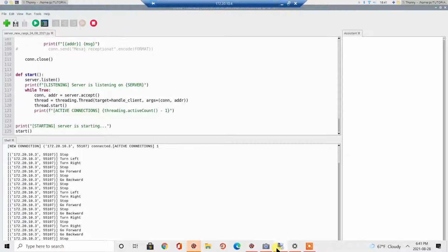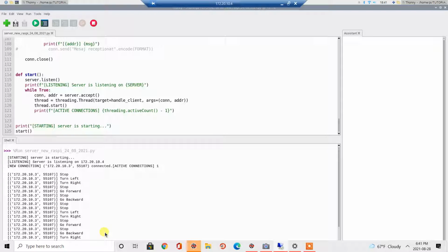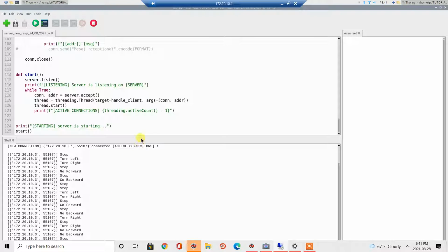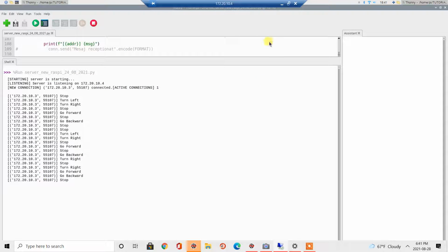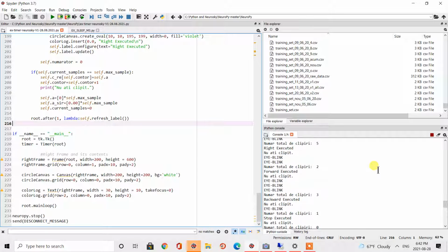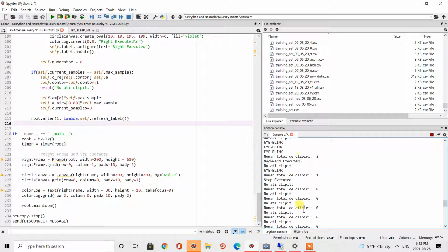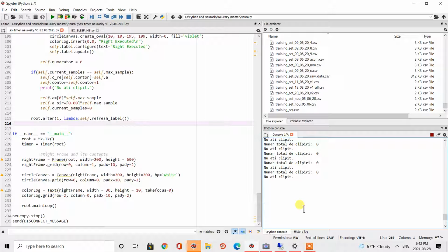At the same time with the execution of the voluntary eye blinks, all the performed commands were displayed in the console of the Raspberry Pi. This is the remote desktop of the Raspberry Pi. Also, the same commands are displayed here in the console of the Spyder development environment. As you can see, right executed, stop executed, forward executed, backward executed, and so on.